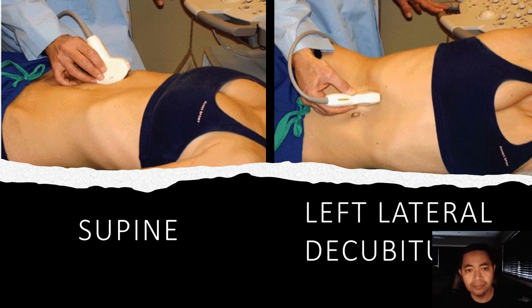The supine and the left lateral decubitus position are the two most widely recommended initial scanning positions, patient positions, to image the gallbladder and biliary system.